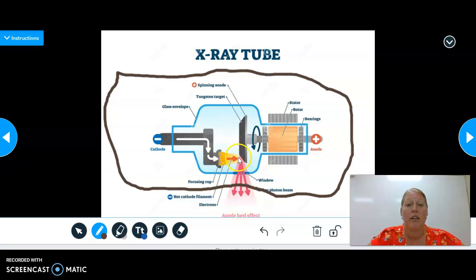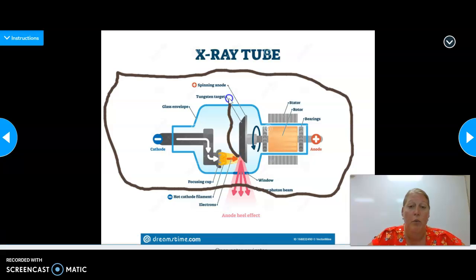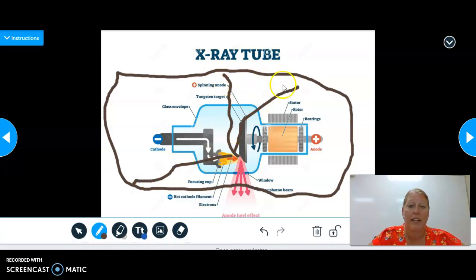These are the electrons that are focused onto the target. But there are some rogue electrons that tend to just fly off. There are many things in the tube that help it to not be rogue, but it happens. So we're going to have leakage. Not a lot, but random, and that metal housing helps to absorb those rogue electrons so as to reduce our exposure to radiation.